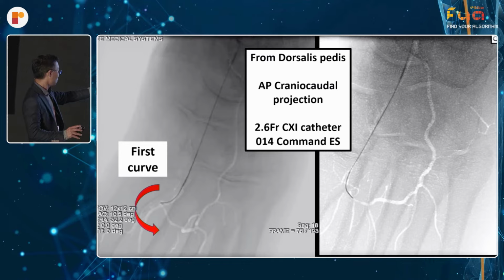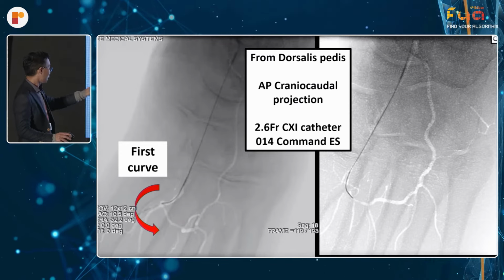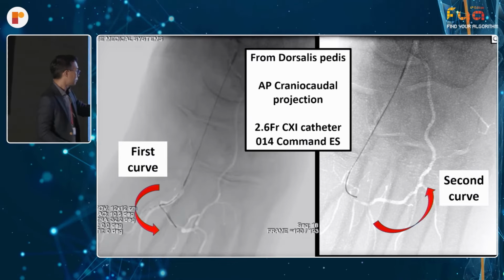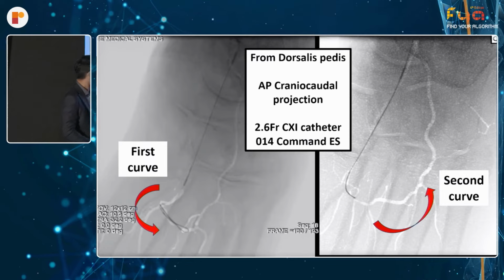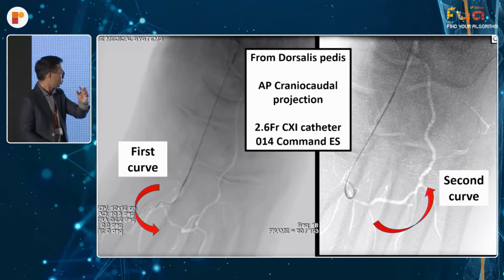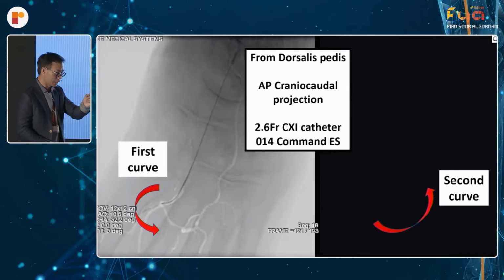So there's always a first curve to cross on the AP craniocaudal. And in this instance, I use a careful knuckle technique. For the second curve, I will push my CXI catheter past the first curve already. And from there, usually my wires I've already pre-made into a little curve.